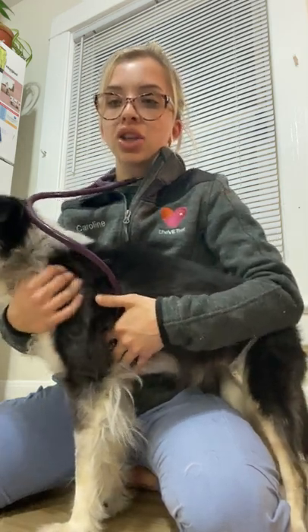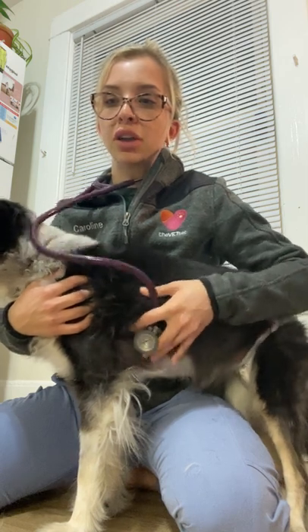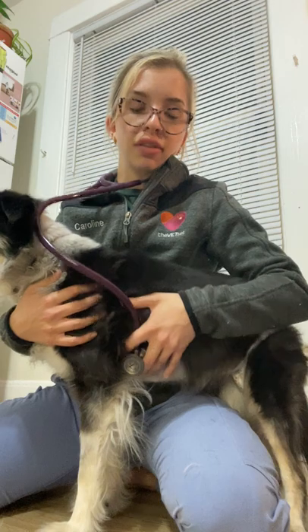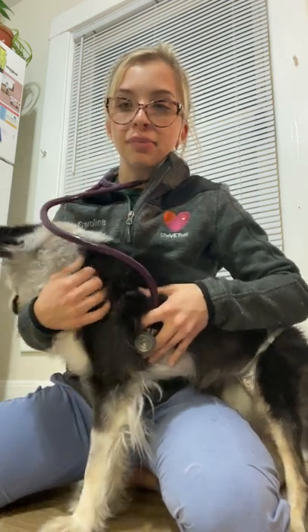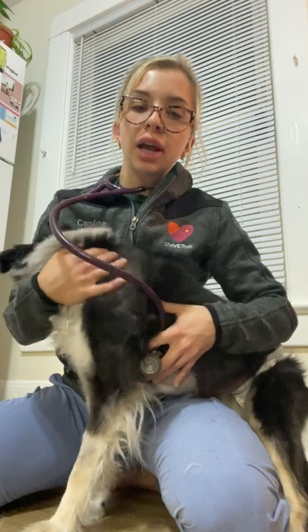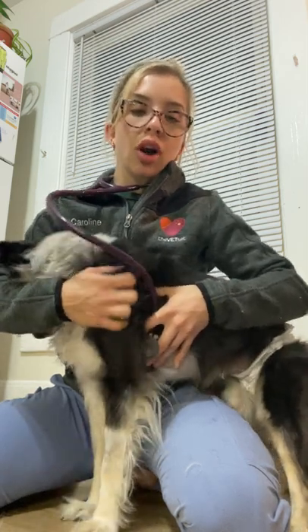Next, just dorsal caudal to this, we're going to now move to the fourth intercostal space and we're going to be listening for the aortic valve, which is also on the left side. Again we're going to be listening for ten to twenty seconds for any abnormal cardiac sounds.